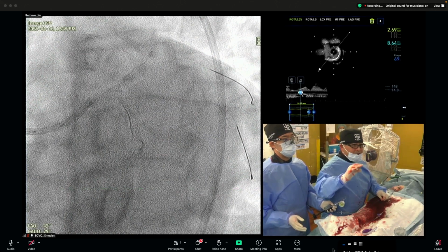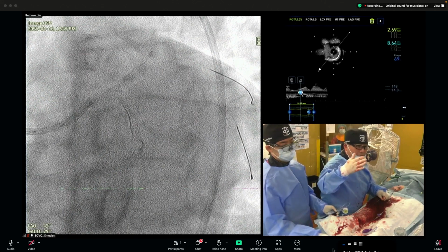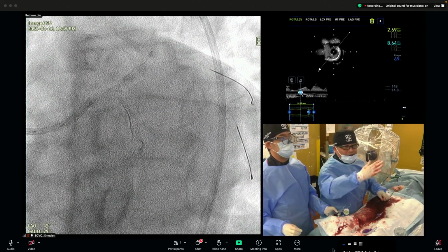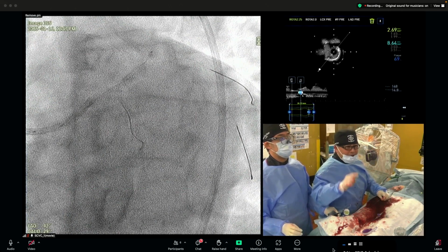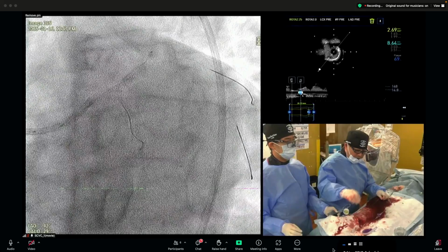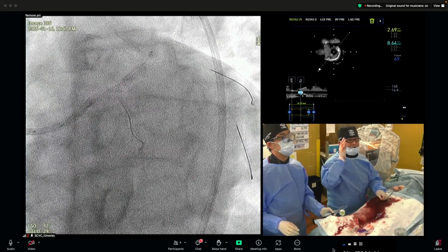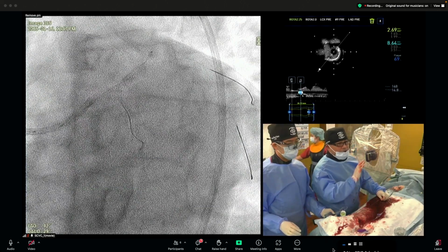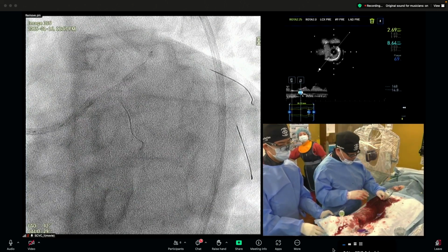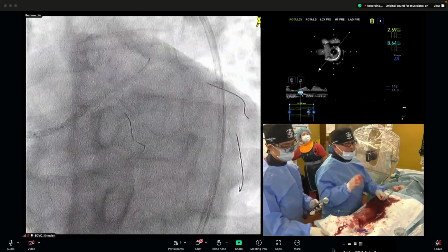Sometimes you push strongly on the vessel wall, and then carina shift happens due to your strong pushing force. If you rotablate gently and properly, nobody gets a side branch occlusion. It's basic physics.